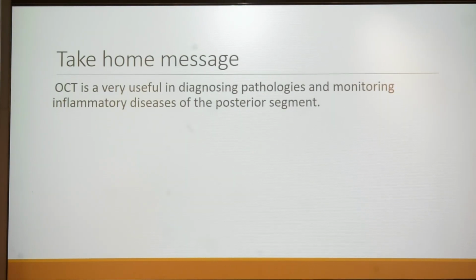So the take-home message is OCT is a very useful diagnostic modality for diagnosis and monitoring the inflammatory disease of the posterior segment. But don't forget about the history and clinical appearance.